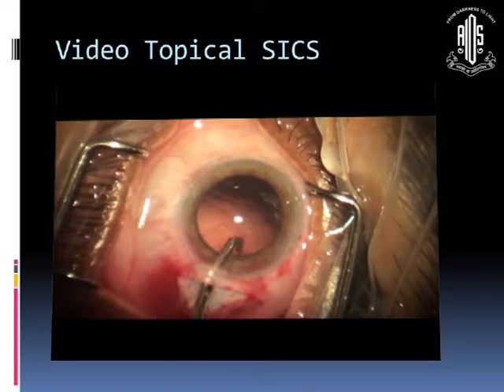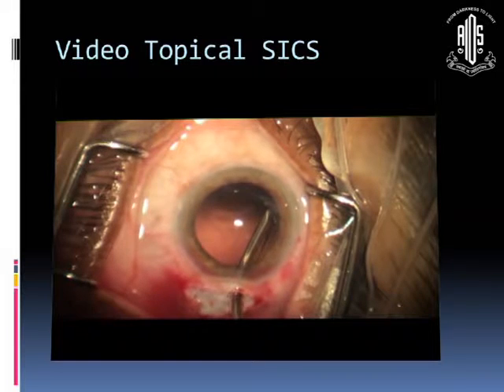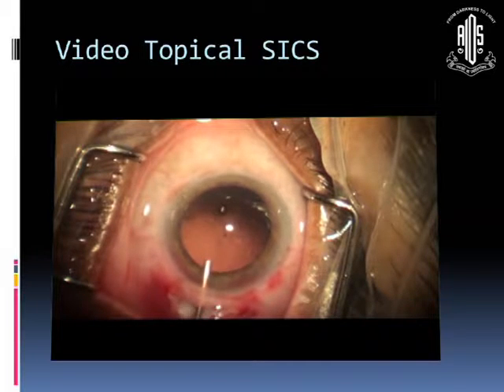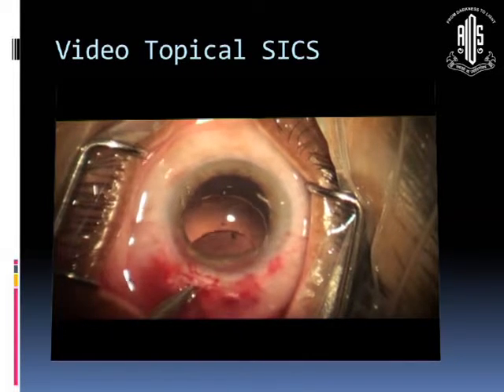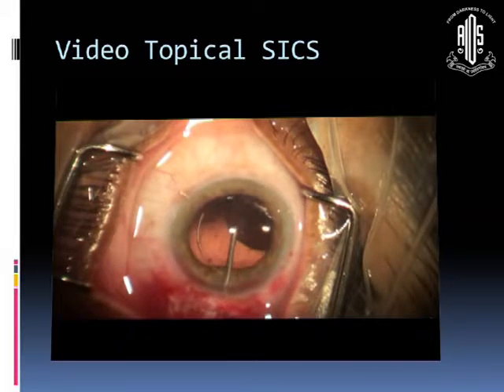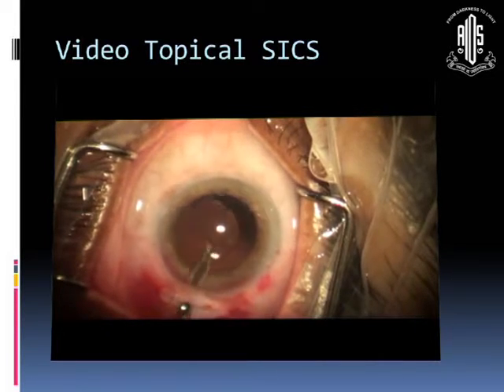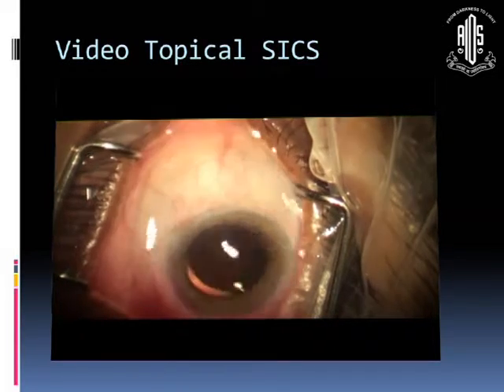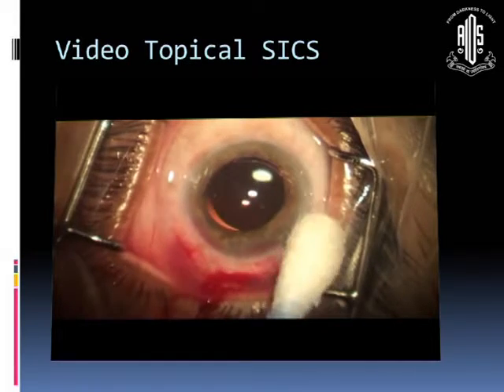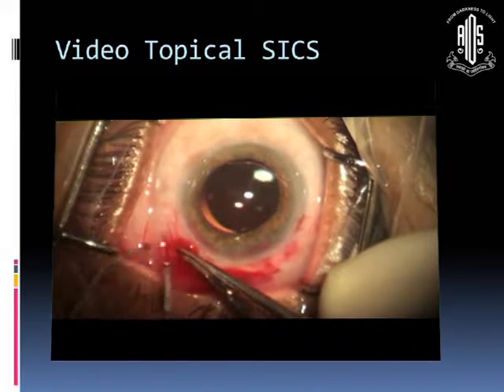Before inserting the intraocular lens, you can augment the anesthesia: once again you irrigate the tunnel with preservative-free lignocaine, and a PMMA lens is inserted into the bag. After removing the visco, surgery is completed. A watertight tunnel and side port is attained, and the cautery is applied.